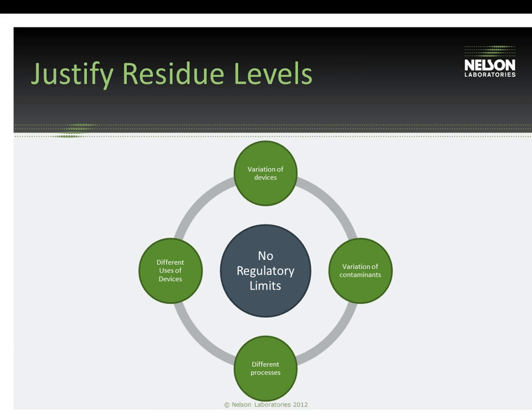And the next step in these cleaning validations, and probably one of the most difficult, is to justify the residue levels. And again, there's no regulatory limit or acceptance criteria for these cleaning validations as a whole, which makes it very difficult for manufacturers. And it's been difficult as well for regulatory industries and FDA to set a limit. There is such a wide variety of devices, the uses of the device, materials used in the process, and the different processes themselves that regulatory agencies have found it difficult to set a number.